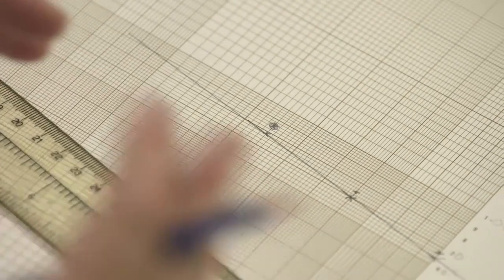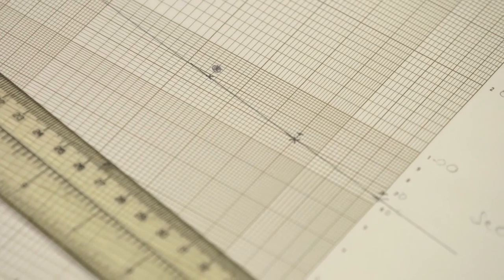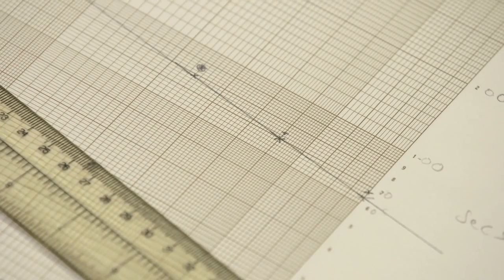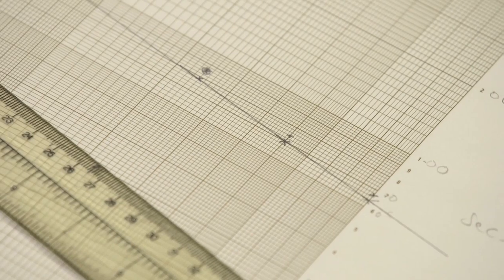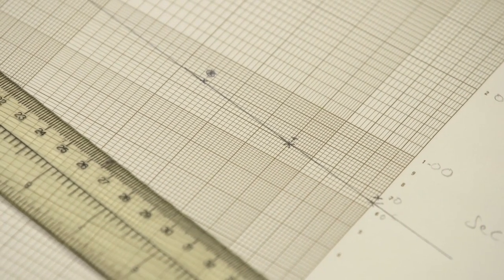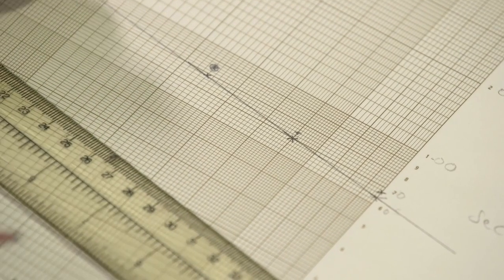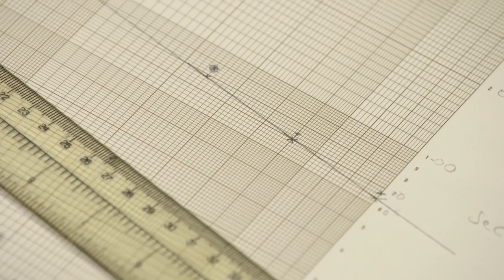So now we have to ask a question for the IQC sample. Do the 3 lines, do the 3 points, do they form a straight line relationship? And is that straight line parallel to the standard? These are the 2 important criteria for a valid assay, that means it's safe to compare, in this case the IQC, with the reference material.